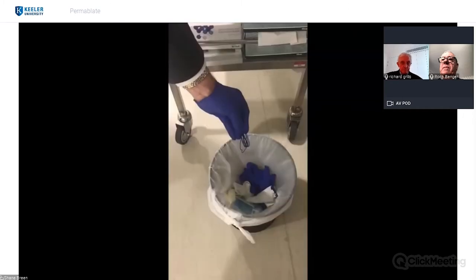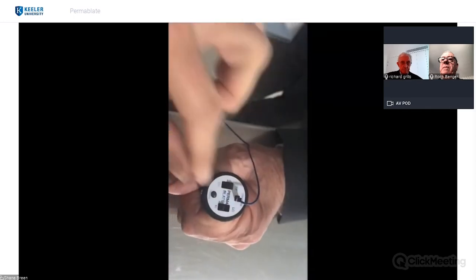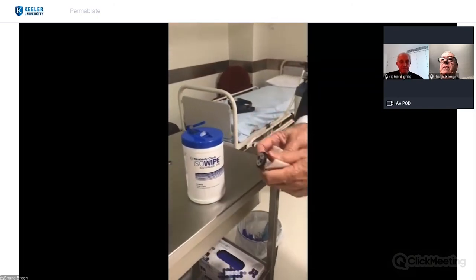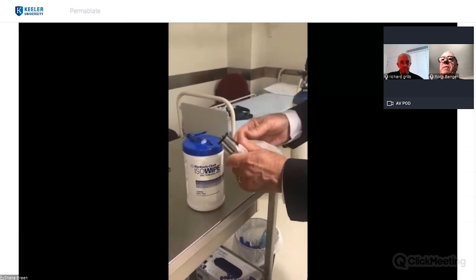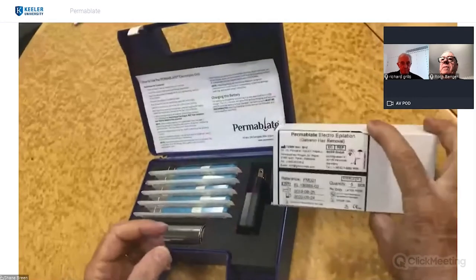At the completion of treatment, dispose of the contaminated sharp needle appropriately, and disinfect the battery ready for reuse with a new disposable single-use needle.